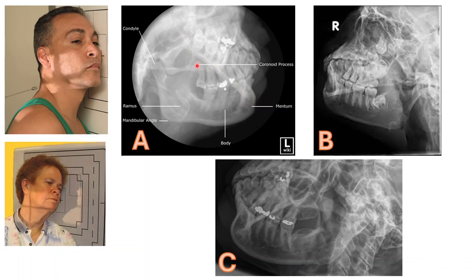Now let's look at image B. I can see that there is definitely not as much distance between the body of this mandible and the opposite mandible compared to picture A. On picture B, we can follow that opposite side from the mentum, see that opaque line, and you can see it coming around.